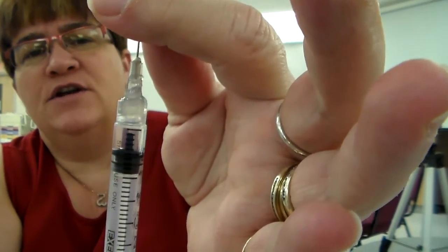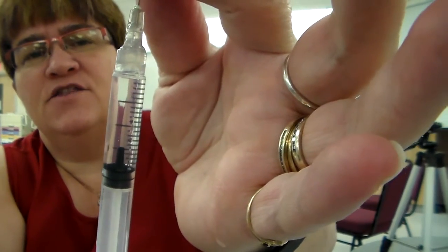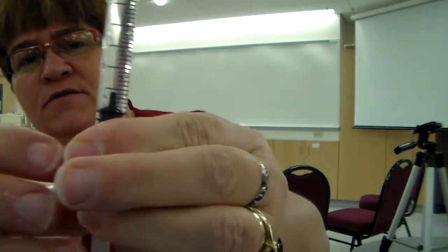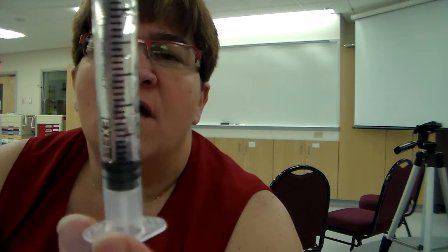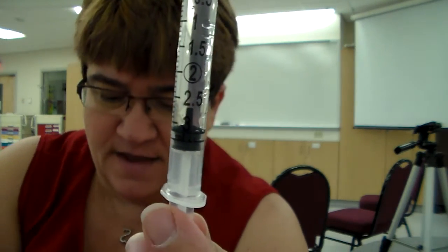Okay, so what you're going to do is you're going to draw back until you get to the 3 milliliter mark. Okay, got it? You're going to hold on to the plunger, hold on to this part, flip a little, okay? Get that air out of there, okay? Make sure you're at the 3 milliliter mark and withdraw your needle. Okay, now you have 3 milliliters of medicine in your syringe, okay? Okay, and then you recap.